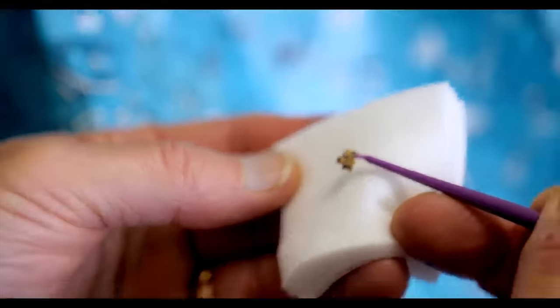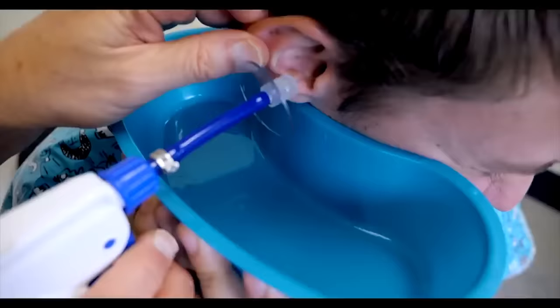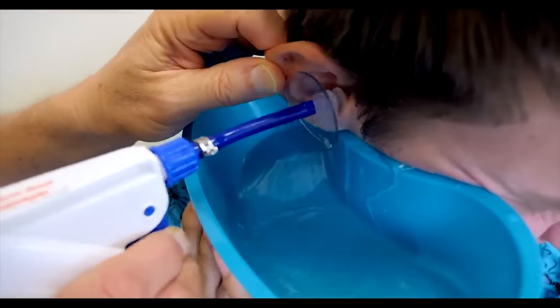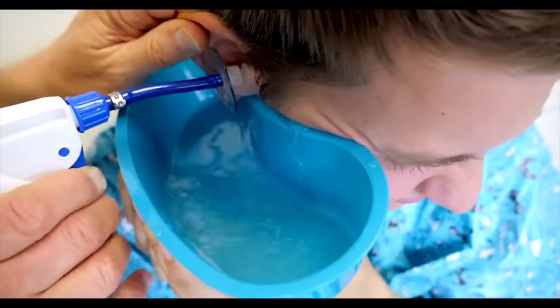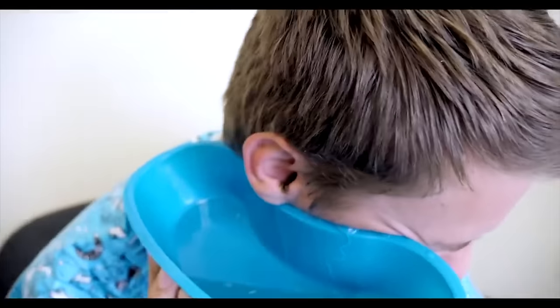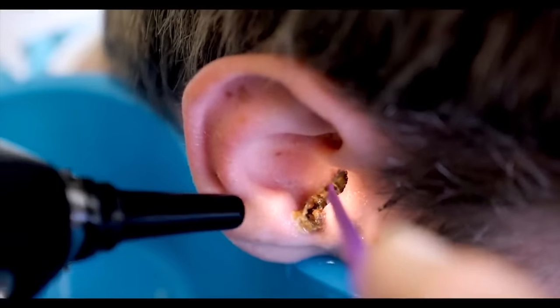Contrast. There you are, a fellow YouTuber — you understand these things. If it starts to hurt, let me know. You okay? Yeah, I'm good. Lots is coming out. There it's coming. Put a light on that. Oh buddy, this is the granddaddy. This is great.